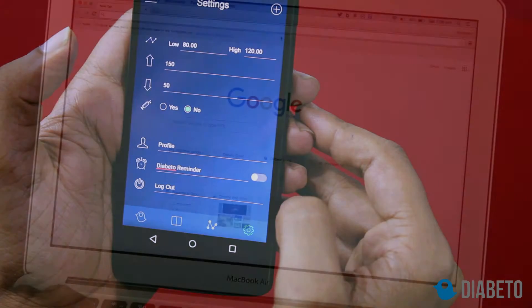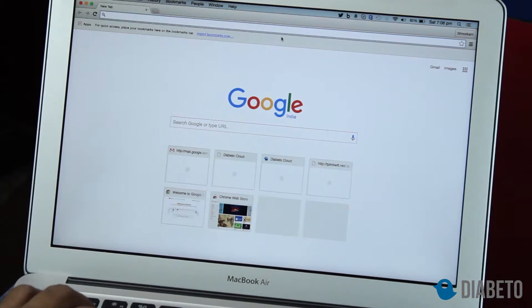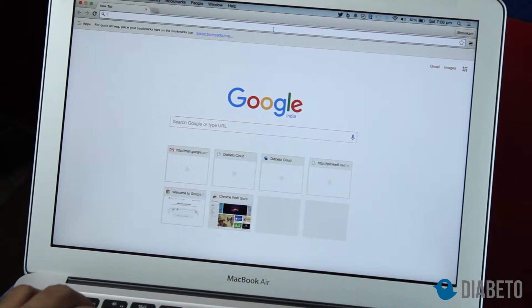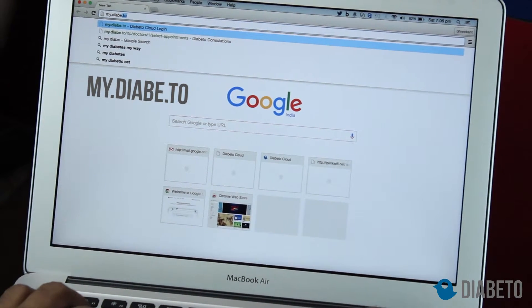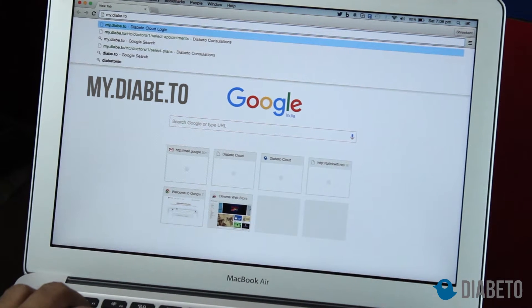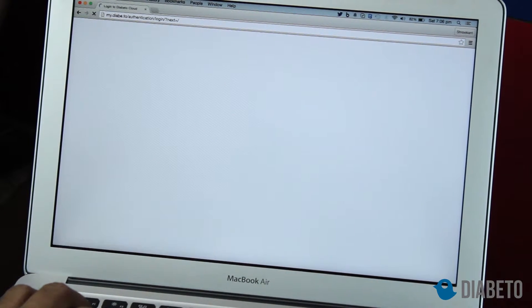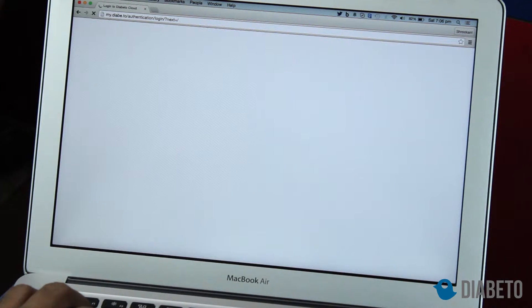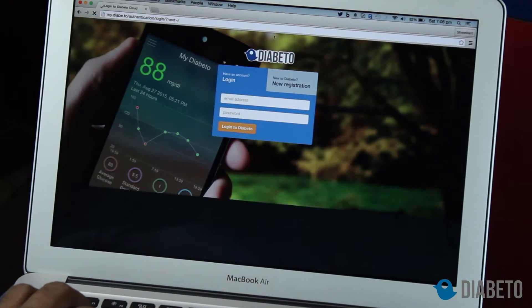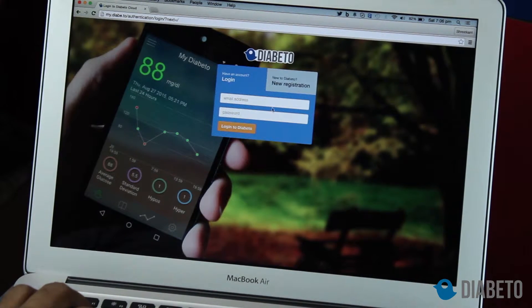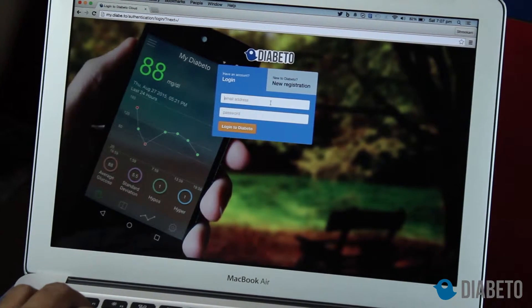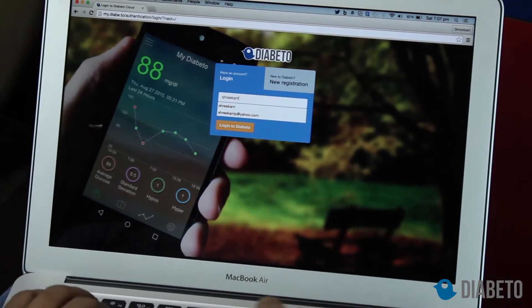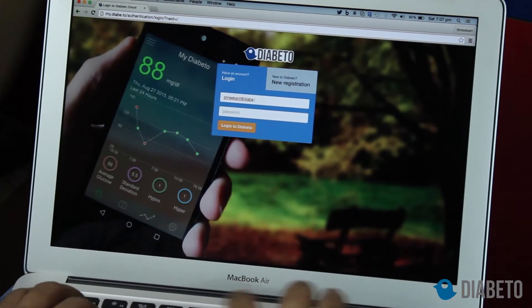That's it about the mobile application. Now let's log in to the Diabeto cloud. Open your favorite browser and type in my.diabe.to. I will use the same username and password I used for the Diabeto Android application and log in to my account.